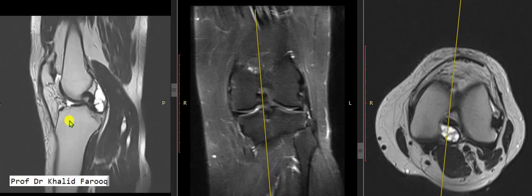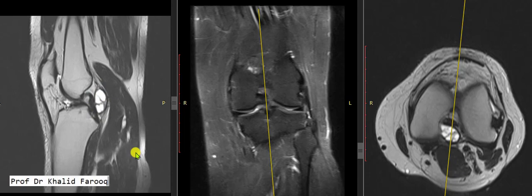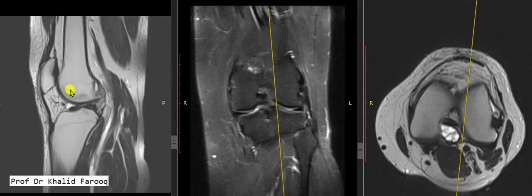This ACL transection results in ACL instability, because of which there is anterior tibial translation. Generally, the signal and morphology of the posterior cruciate ligament appears unremarkable, while we can see multi-septated ganglion cysts behind the posterior aspect of the posterior cruciate ligament.